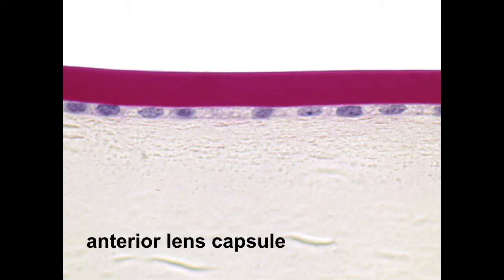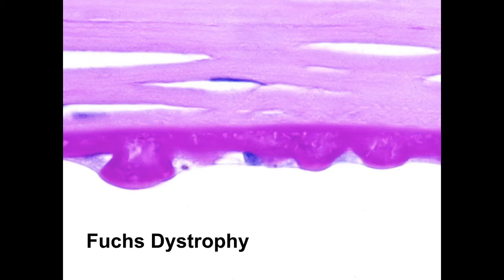Here's a photo showing the anterior lens capsule stained with PAS. Here's an example of guttate excrescences on Descemet's membrane in a patient with Fuchs dystrophy.